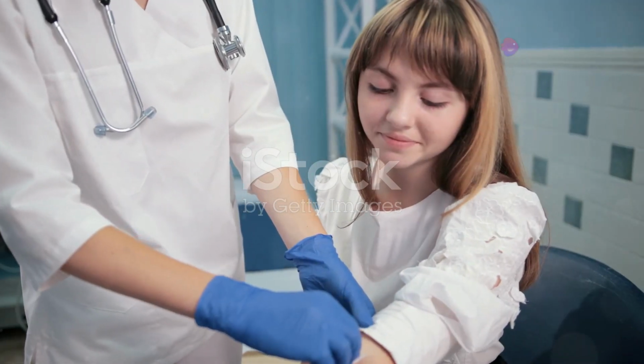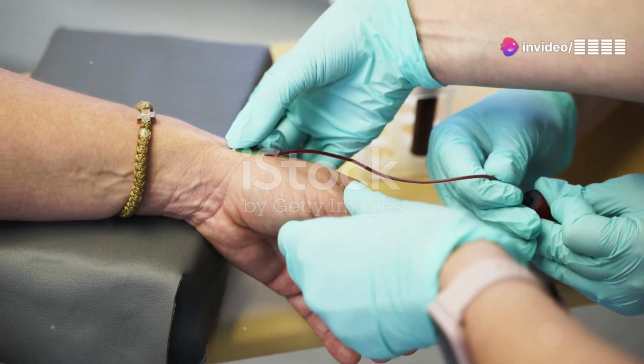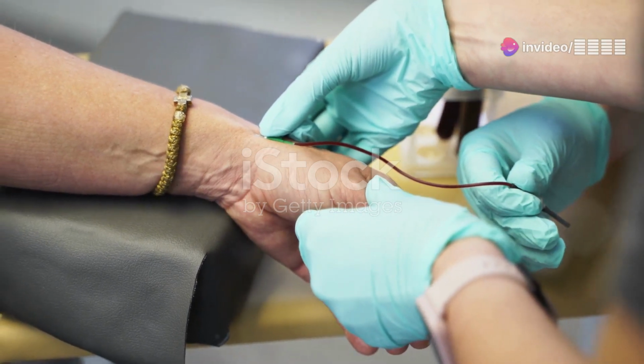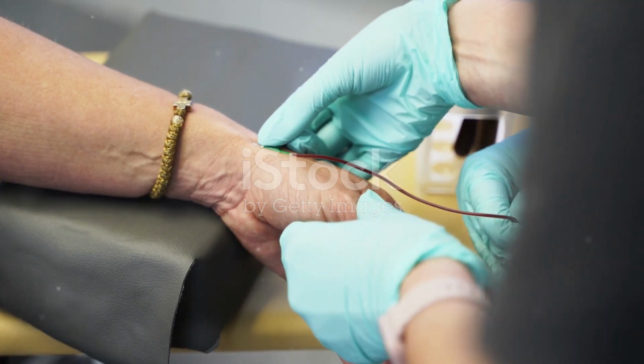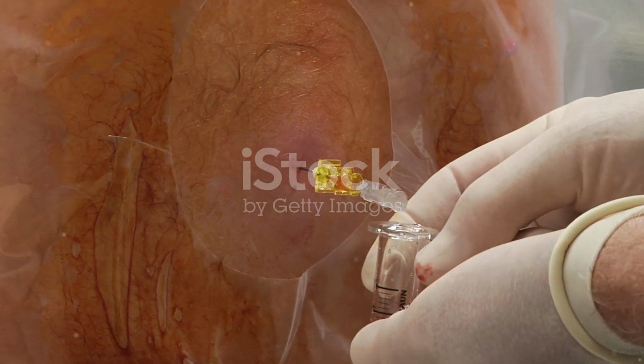Collecting an ABG sample involves a slightly different procedure than a typical blood draw from a vein. Instead of a vein, a small amount of blood is drawn from an artery, usually in the wrist. Arteries carry oxygen-rich blood, providing valuable information about lung function.